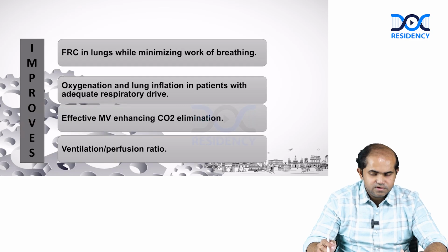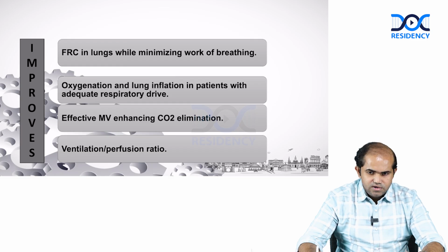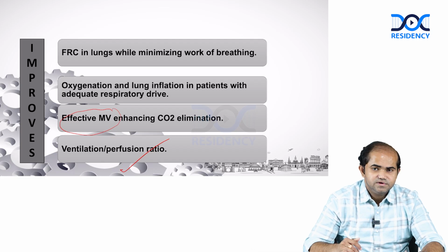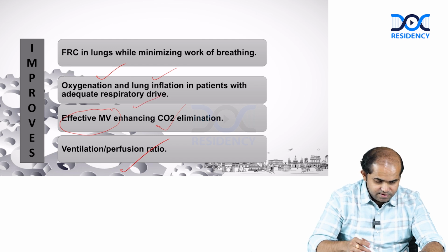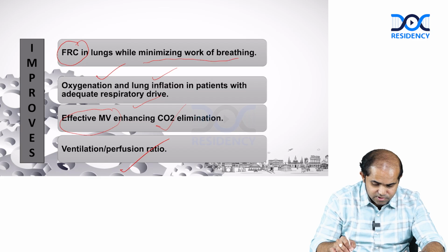So what is the physiological basis of NIV? When you start NIV, your VQ mismatch will get better, it will give effective mechanical ventilation where it will enhance your CO2 elimination, and it will improve oxygenation, lung inflation with adequate respiratory drive, and improve functional residual capacity in the lung while minimizing your work of breathing.